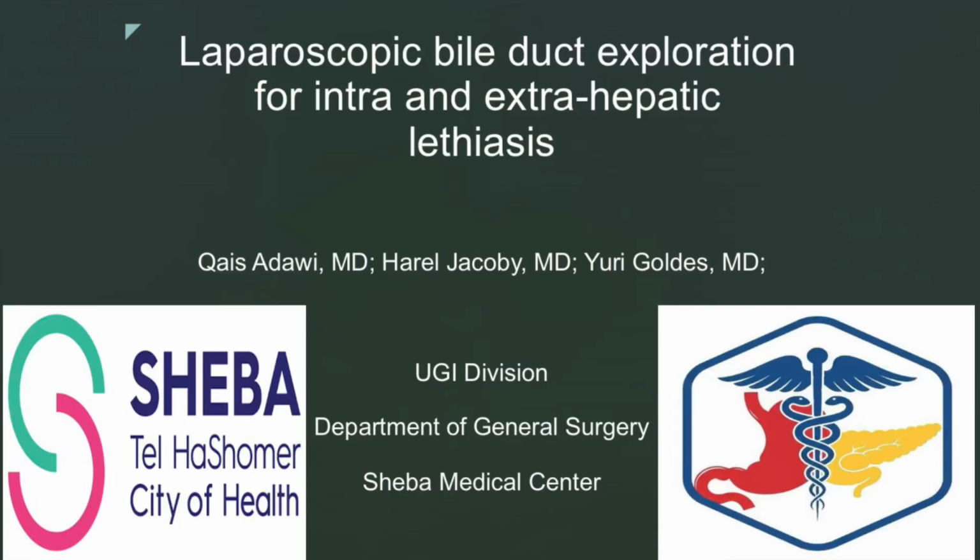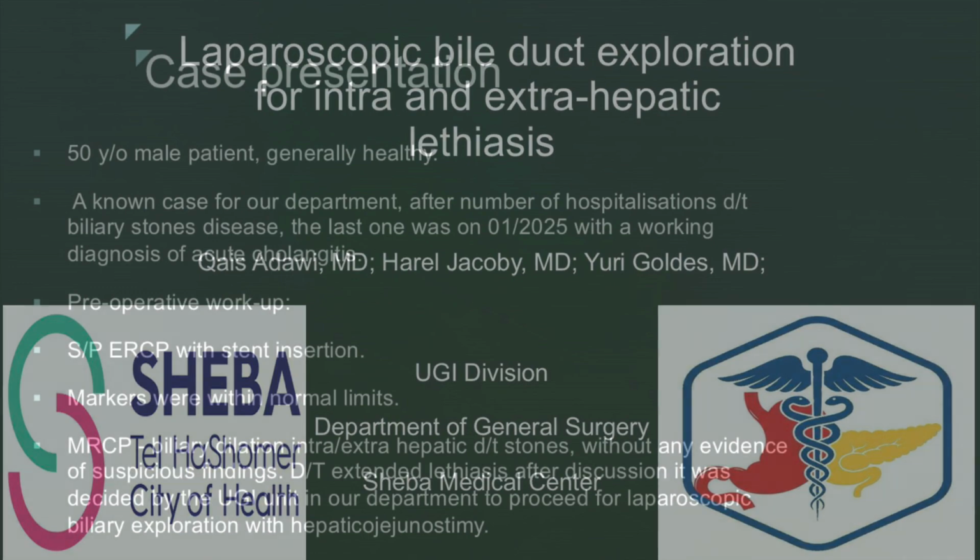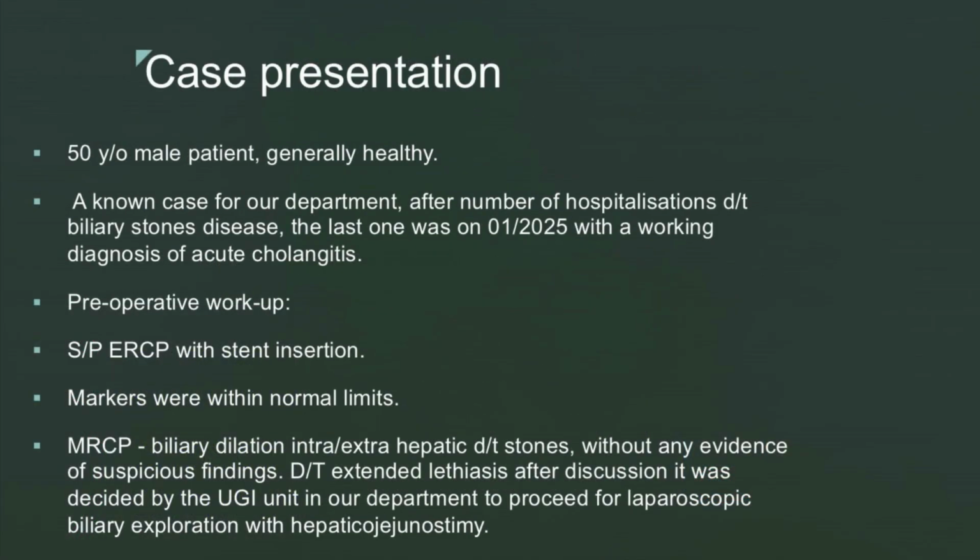This is a laparoscopic bile duct exploration for intra and extrahepatic lithiasis. Our patient is a 50-year-old male who is generally healthy except for active smoking, well known to our department from hospitalizations for symptomatic lithiasis and acute cholangitis. As part of treatment and investigation, he had undergone ERCP at least twice, with plastic stent insertion.